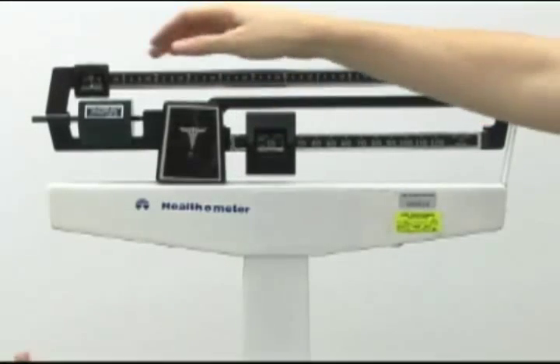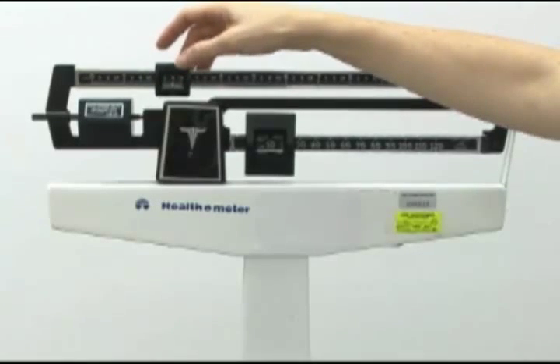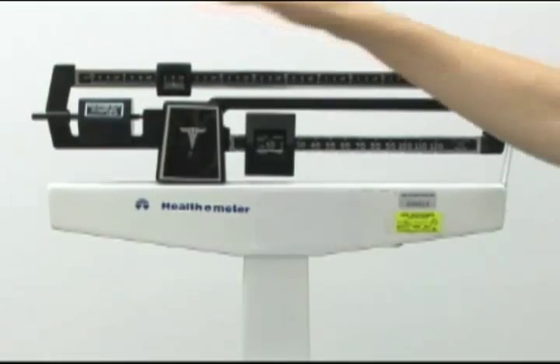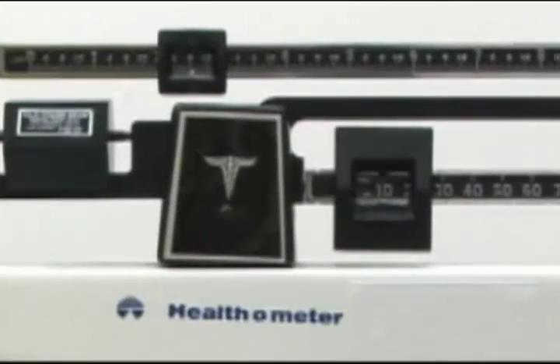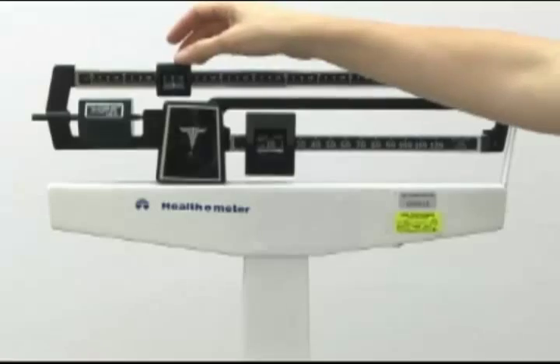Move the lower weight over to the right until the indicator arm drops down. You can then move the smaller weight over to the right until the indicator arm balances in the center. Record this measurement to the nearest one ounce. And that's how you measure the weight of an infant using a balance beam scale.